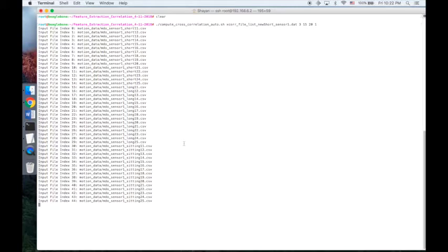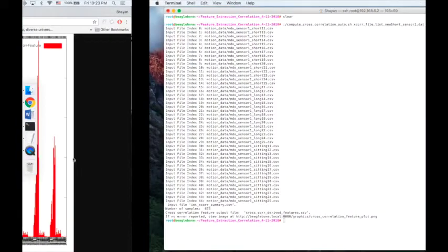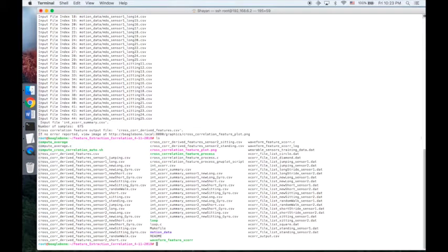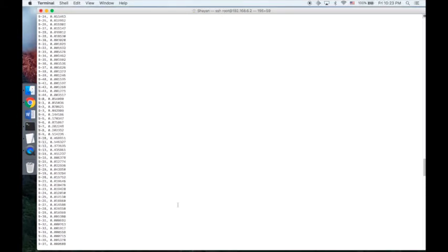It will perform the operation for all the 15 short stride motions versus all of the files. So the indices will start from 0, 0, 0, 1, going up to 0, 44, then 1, 0 going up to 1, 44, similarly going on to 14, 0 up to 14, 44. Here is the graphical representation of the extracted features. And here is the numerical representation of the features computed by the system.